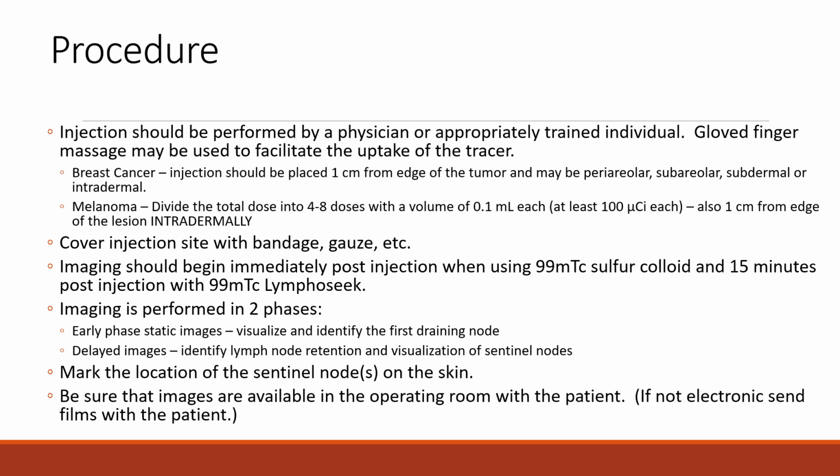Some protocols will not do imaging at all. I hate that, because I'll tell you why I hate that. Now, in some cases, it might be okay. I have done a breast lymphoscintigraphy before. We injected it, the doctor injected it, actually did a good job. And then this was like, your breasts are anterior, right?